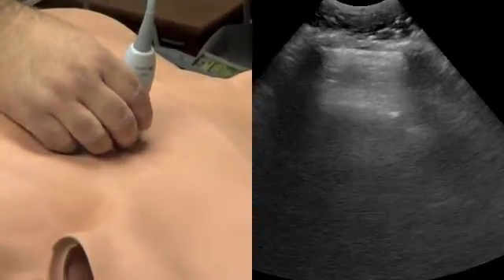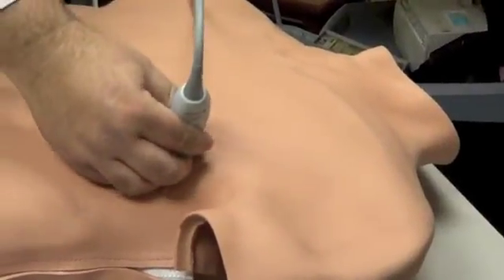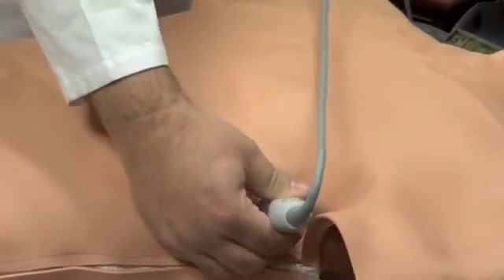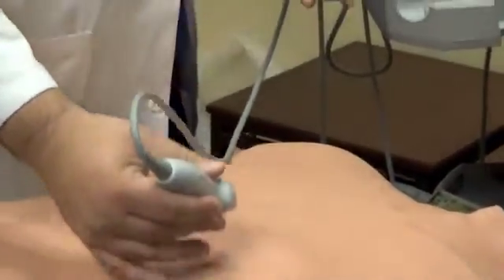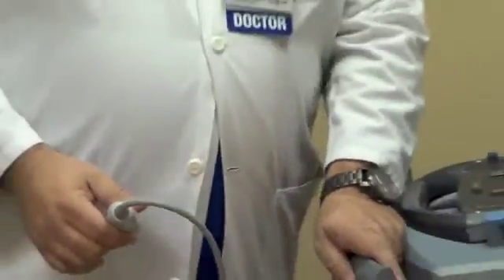You want to look in both fields — there's, of course, cardiac activity on the left side. If you do see bilateral A lines, you should proceed and do a DVT study on your patient. There's also a separate video that will show you how to do a proper DVT scan.